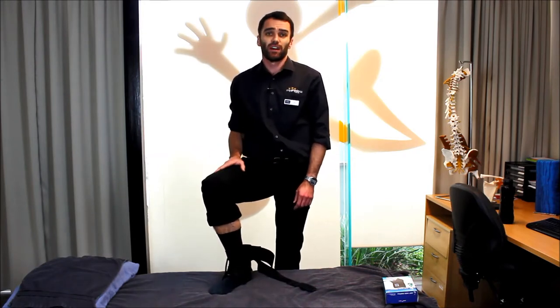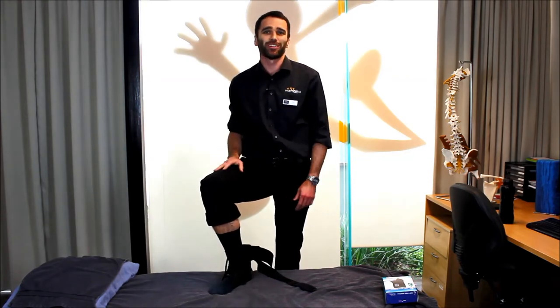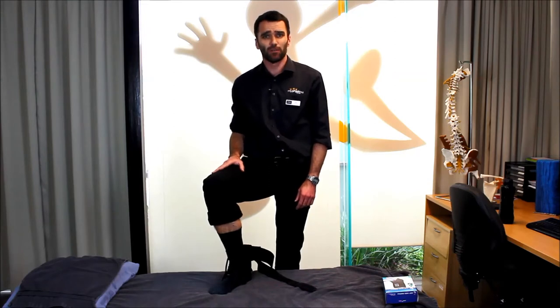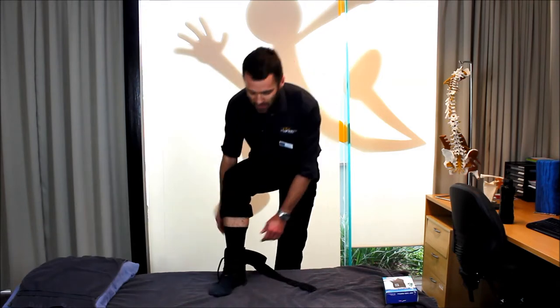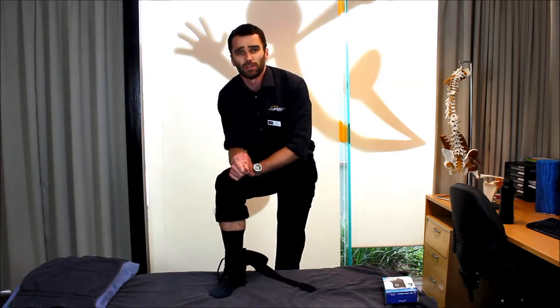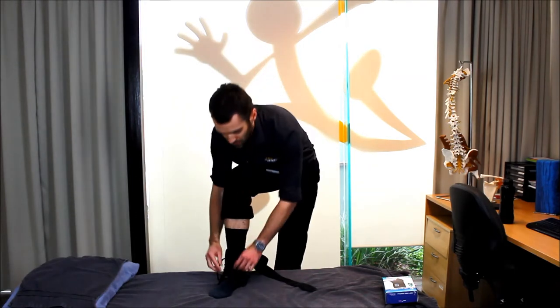The first thing you'll notice is that I've got my sock on underneath. In a sporting setting, you'll wear a thin athletic sock underneath your brace to prevent any rubbing or irritation of your skin. I've just popped the brace on loosely. In terms of lacing it, we want you to lace it up nice and snug.